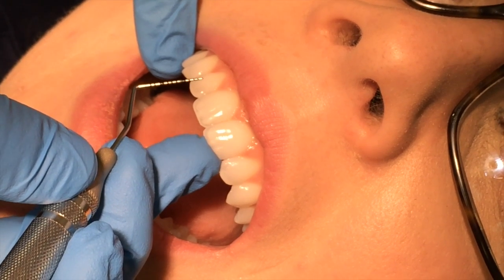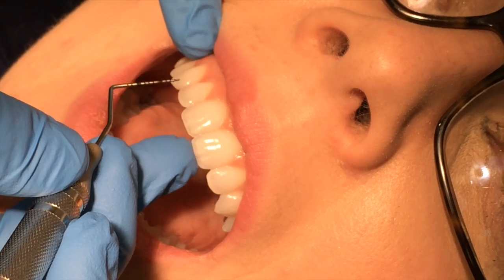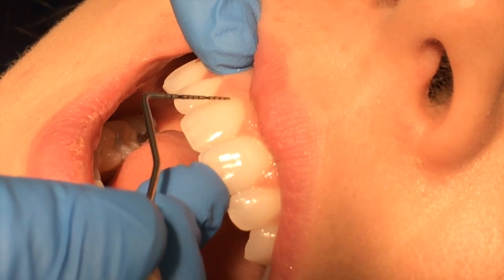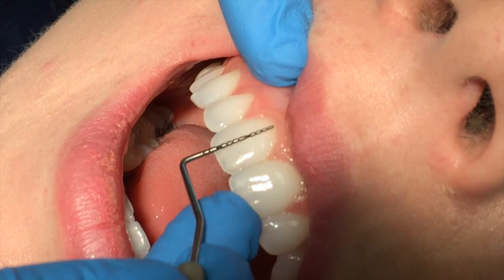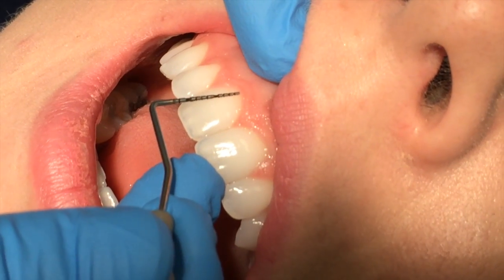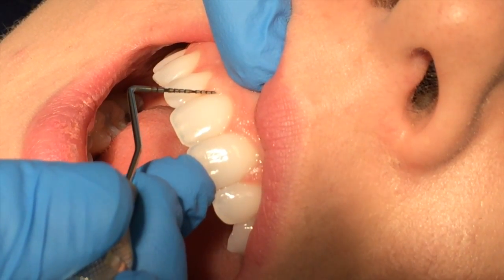Adaptation is making sure that the working end is parallel to the long axis of the tooth. Remember to keep the last two millimeters in contact with the tooth to help with this. Commonly, clinicians are flexed too far out or too flat against the tooth — either way, you won't be able to access the sulcus. Making sure that the last two millimeters of that probe are tight against the tooth will ensure that the probe is parallel to the long axis of the tooth.